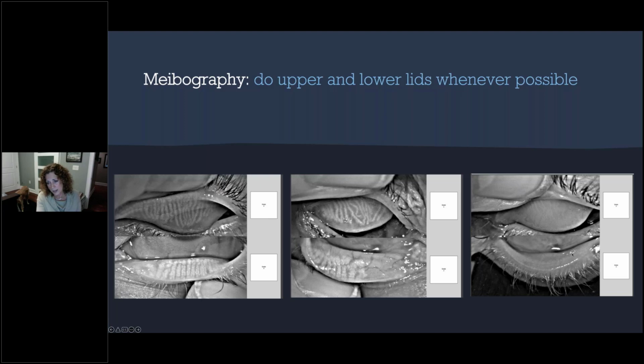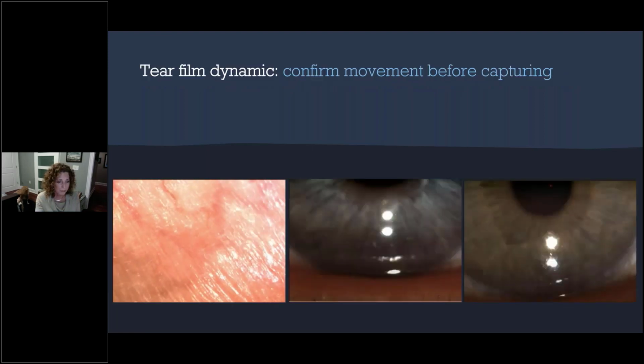And this is one of my extreme patients. This was just the other day, actually. Nothing, really no glands on the bottom. We just have 4 or 5 up top. And when they're this skinny, it's hard to say if we'll be able to really recover function out of those glands. And I will say I've been surprised before.